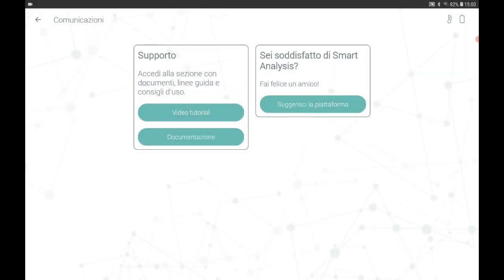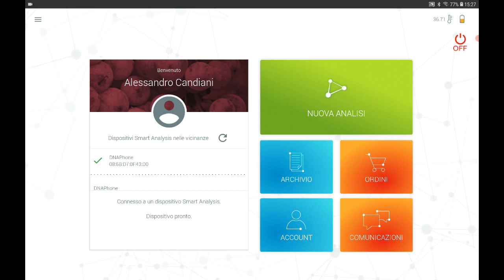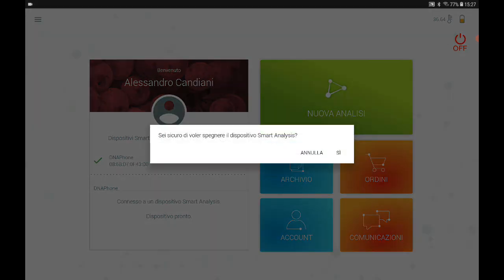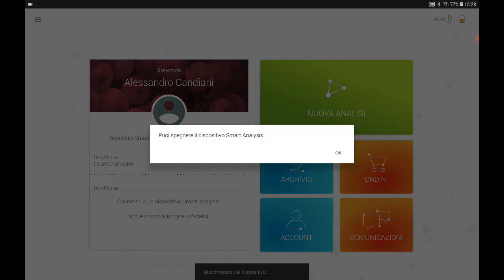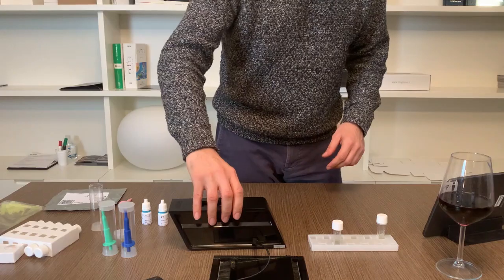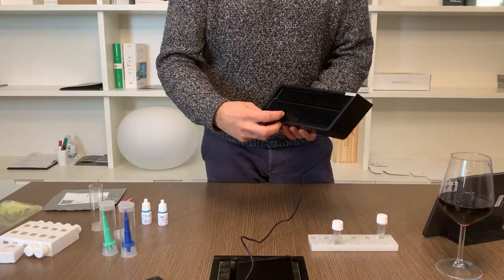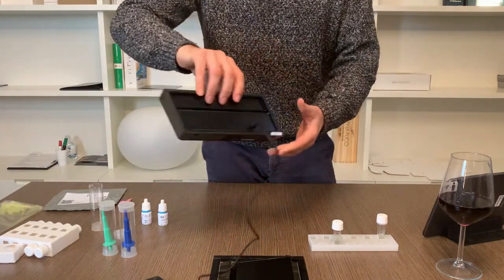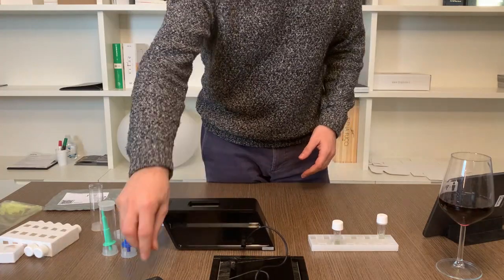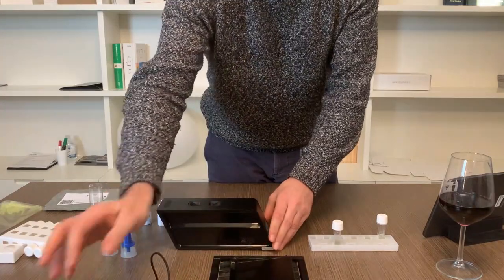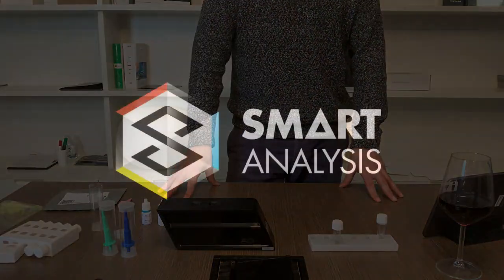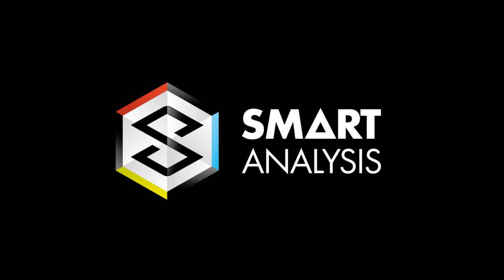At this point we are done, so you can switch the instrument off. In the top right hand corner you will find the shutdown button. Click it and at the moment when the application tells you that you can physically switch off Smart Analysis, you can proceed with the physical switch off. Once this is done, you can close the application and you are finished with your operations.